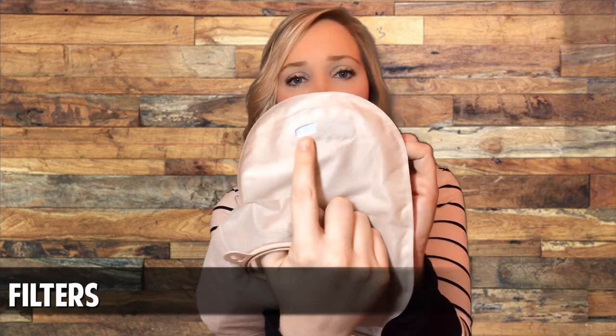Another thing you might have noticed is that some ostomy pouches have a little filter on them and some don't. The ones with the filter have a little bit of charcoal in there — it lets odors pass through it and the charcoal is supposed to neutralize those odors. This is the mini Lock and Roll drainable ostomy pouch — it also has a filter. It is 18282. You can see that when the Lock and Roll closure is rolled up at the bottom, it is pretty much smaller than my hand.